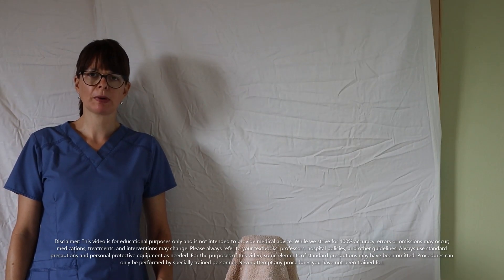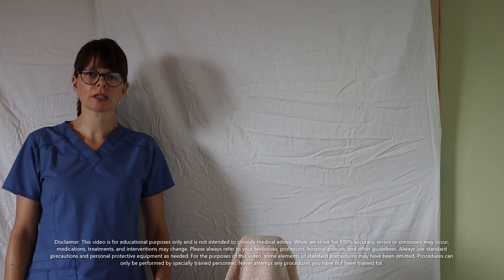Welcome to Nursing School Explained and today's video on the insertion of an indwelling catheter in a male patient. Keep in mind that this is always a sterile procedure and we have to make sure that we follow the sterile field requirements to the T when we perform this procedure.